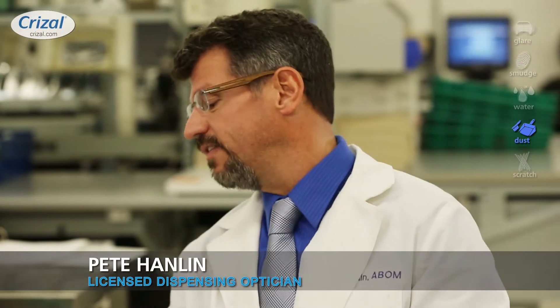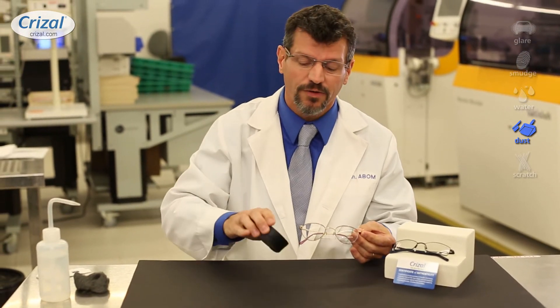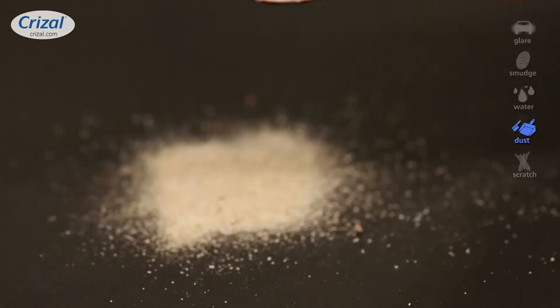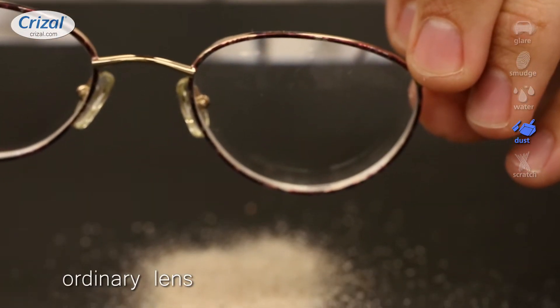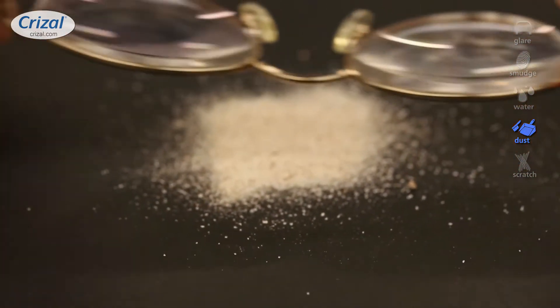Another enemy of clear vision is dust. So where are you going to get dust? When you clean your lenses with a tissue paper — which we tell you not to do — you're going to have all those little paper fibers and other things in the air. And if you have a regular lens, you're going to notice that the static electricity you build up is going to cause that to stick right to the lens.